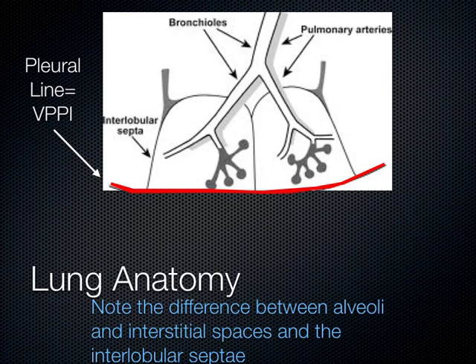Also, in most people these interlobular septa are about 7 millimeters apart. It's not key that you remember that number per se, but just approximate in your head about how far these structures are apart.